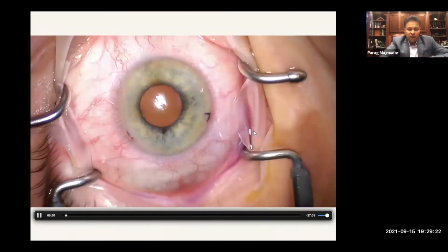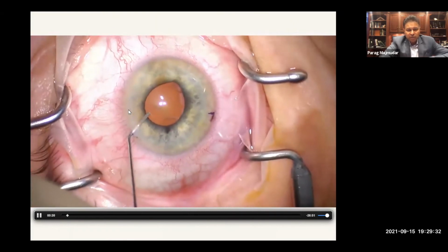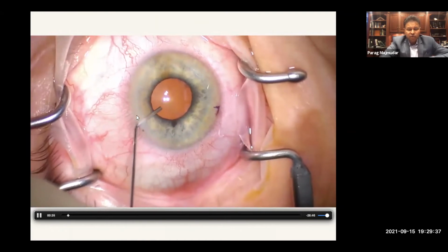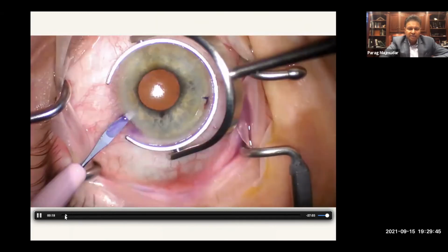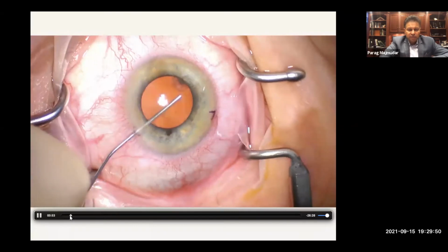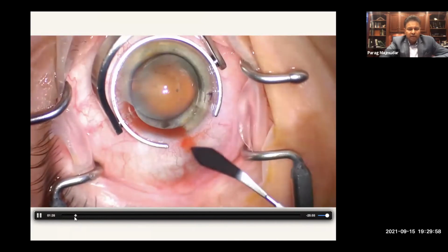You can see here that this is the inferior portion of the iris. This is superior, and I'm operating on the left eye. And I didn't make my paracentesis right here inferiorly at 6 o'clock because I'm making my inferior PI there. I'm using a combination here of the epinephrine and lidocaine, and you can see here that the pupil before we start isn't super dilated, but it'll get more dilated as I'm using the epi-lidocaine mixture, and then I'll add a little more viscoelastic in and get it to be fairly big for my cataract procedure.